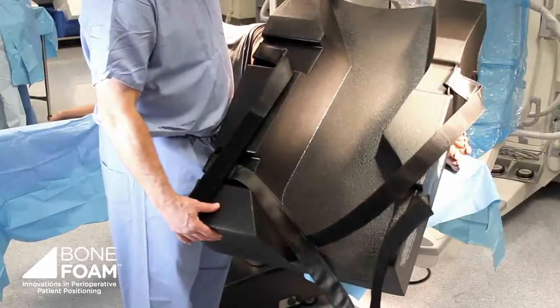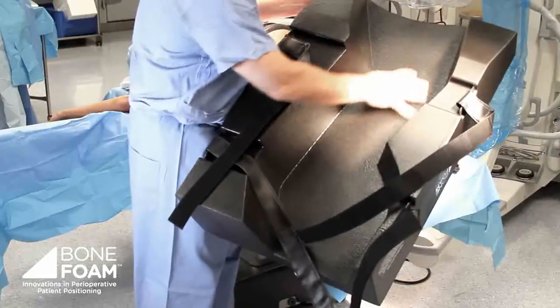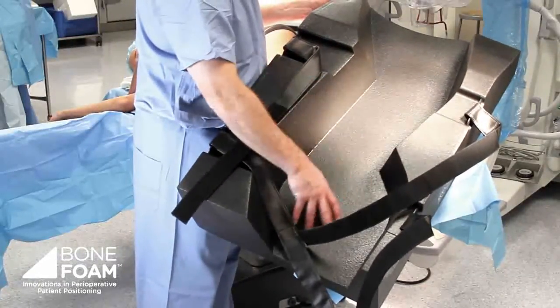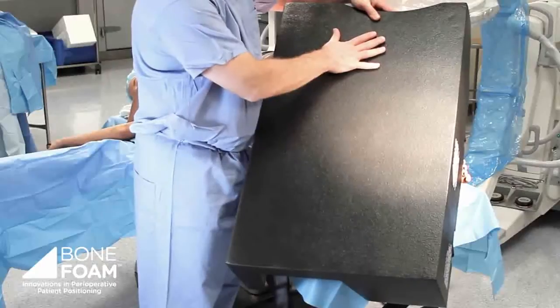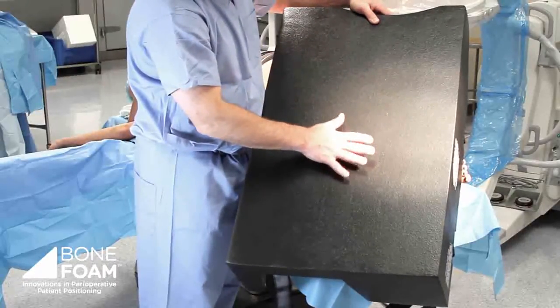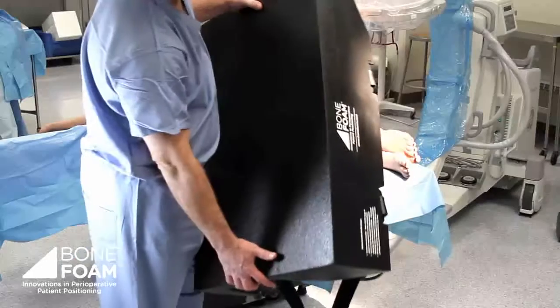This is the undersurface, which is what the piece is named for, the leg tunnel. So this will accommodate the down leg. And I'm going to flip it over. This side will become the surgeon's working surface. The top leg, the leg in which the surgeon is working, will lay on top. This cutout here accommodates the groin.